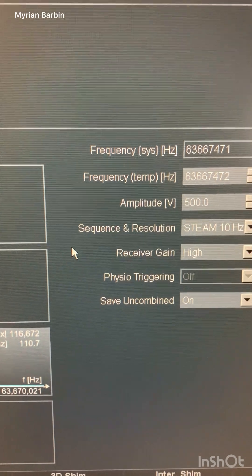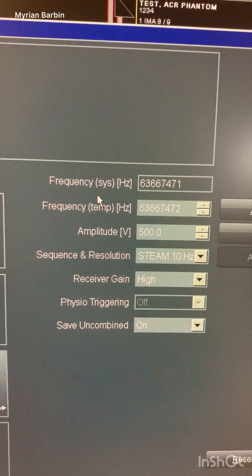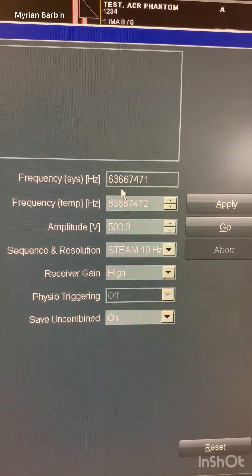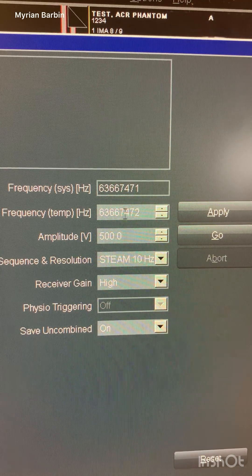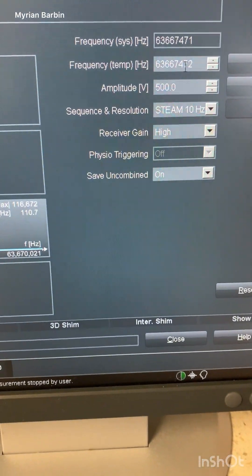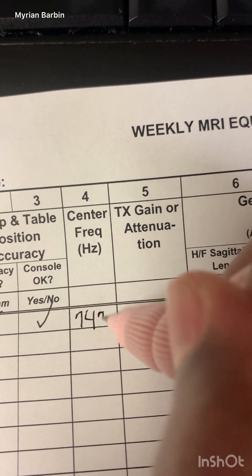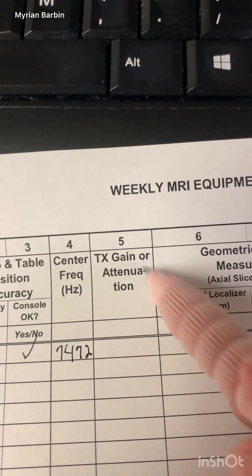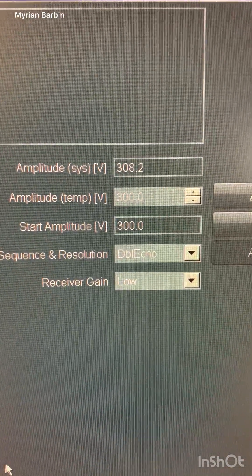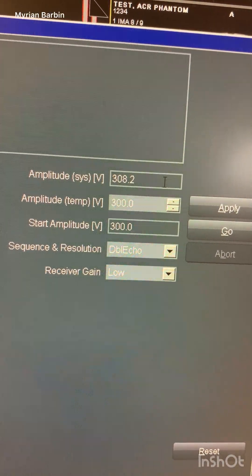Once you're in the Adjustments tab, you can see everything about your frequency right there. Just write down your numbers. For the gain, look at your transmitter — write down those numbers. You can also see the receiver gain at the bottom of that screen.